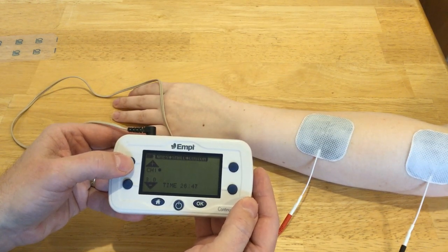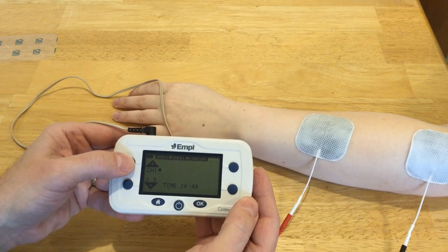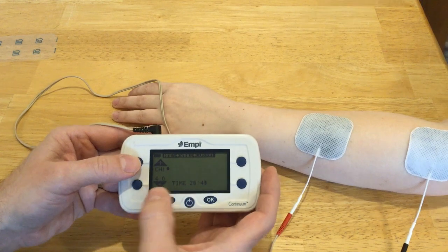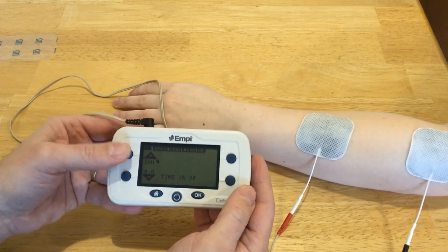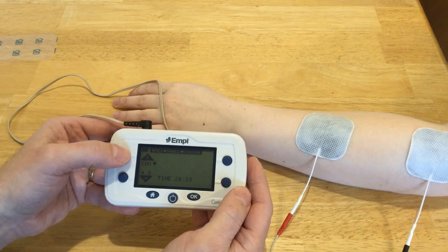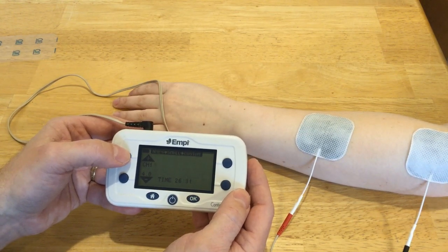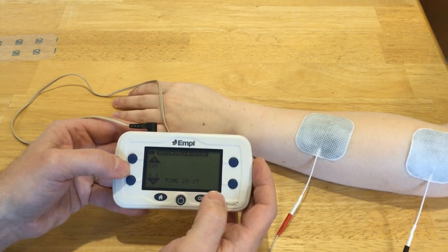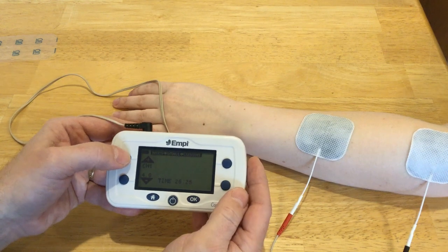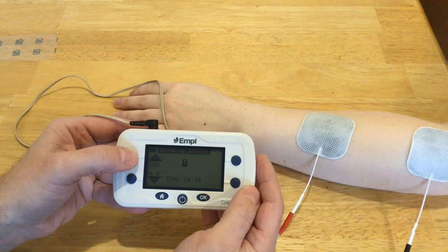She felt something at 4.0 intensity, and that's generally where people start to cross the strength-duration curve for sensory — somewhere around four or five. Now you see the dot just went away, meaning it's doing its off time. We want to get to a motor response though, so I'm going to continue to increase the intensity.